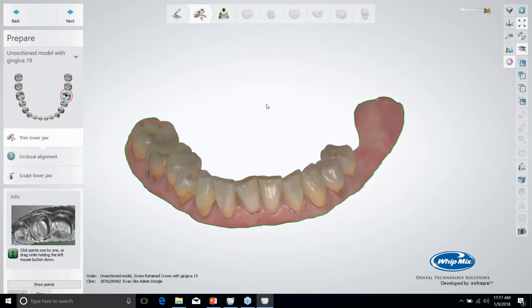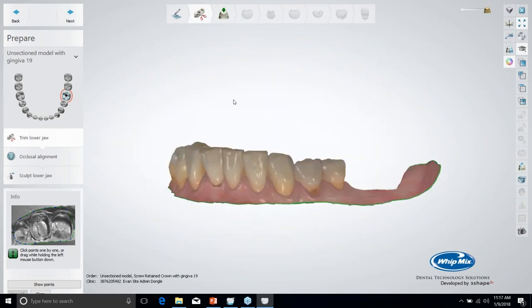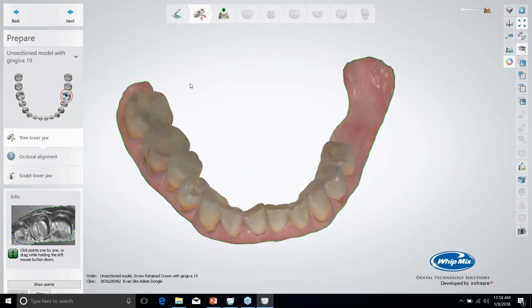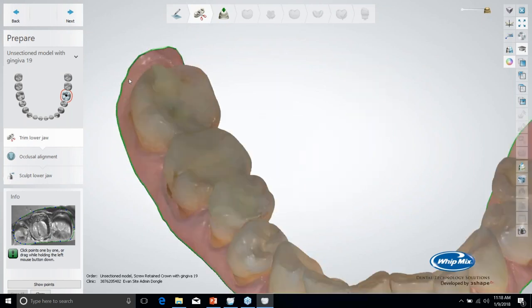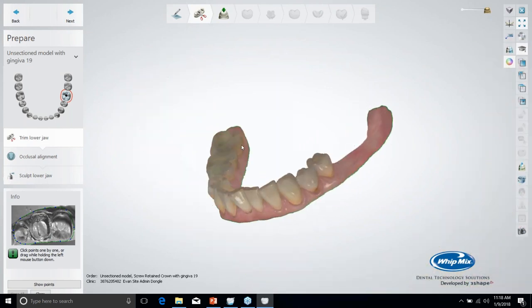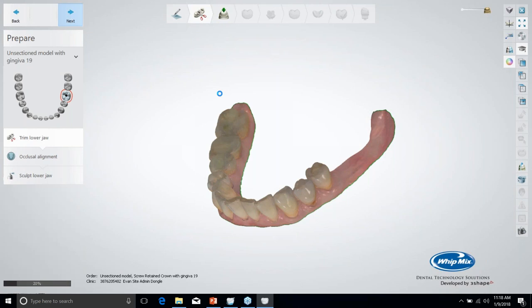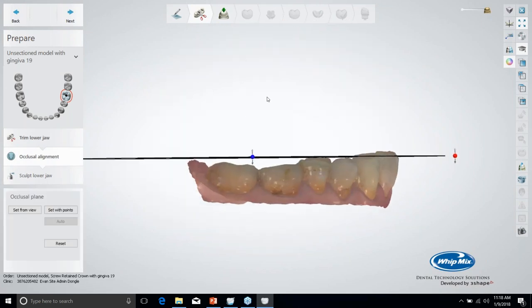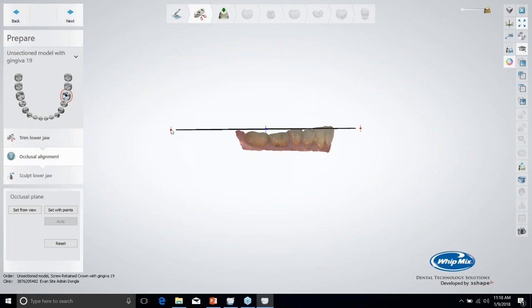Because this is an intraoral scan, it's going to ask me to go ahead and trim it, but it's already been trimmed. If you were going to trim anything here, you just draw your new border and it'll trim stuff off. Next, you need to set the occlusal alignment. Now, if you're using 3Shape and you're getting scans from a Trios, this should already be set up pretty well if it was scanned properly.